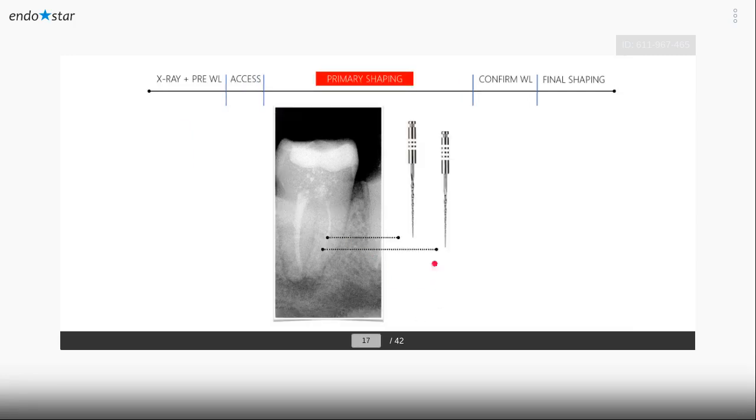After that, I will not talk about easy canals like distals or palatal. I will talk now about mesial systems that are more complicated. We'll go step by step further, and we will remove more of the previous material by using the third and fourth instruments.